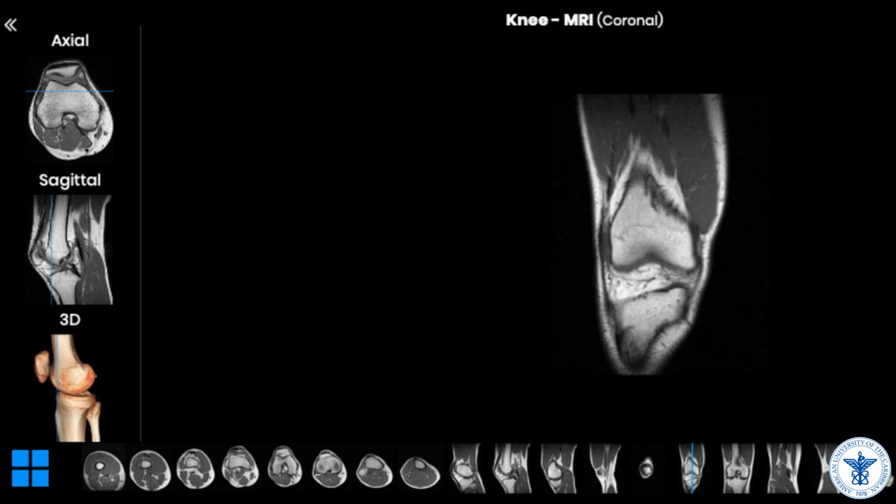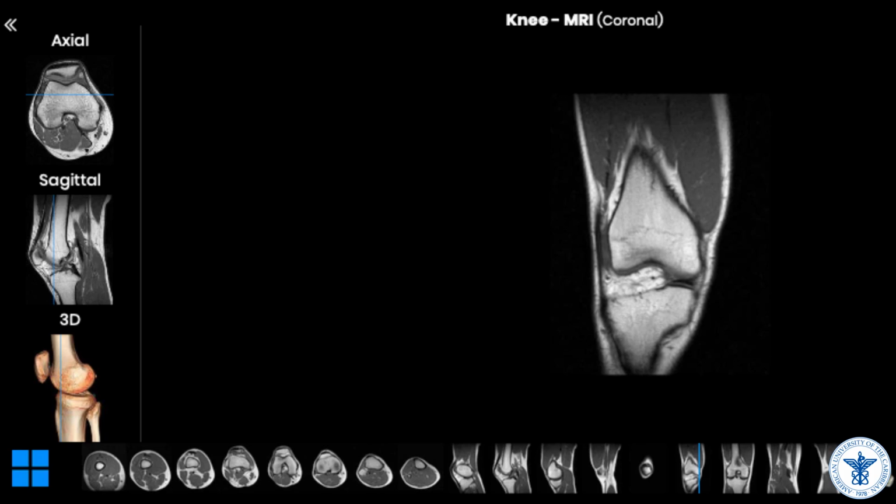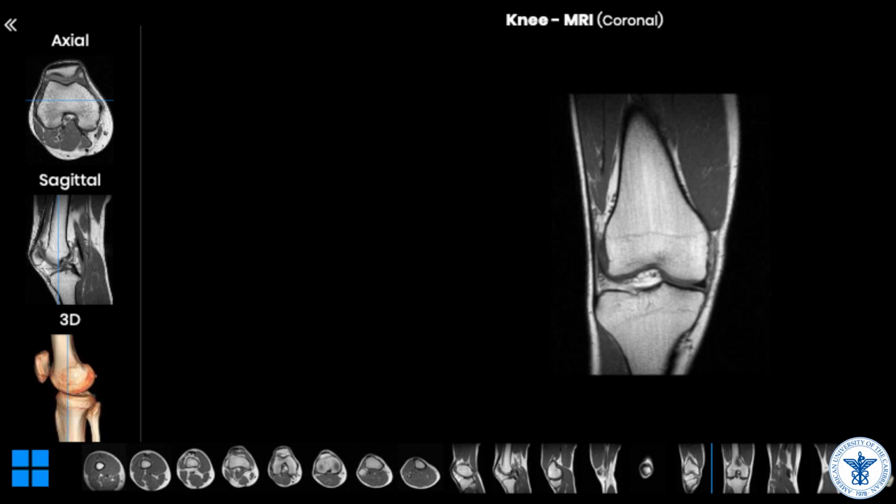And you see the other components of the knee joint, the distal end of the femur with two condyles appearing above, and the upper articular surface of the tibia appearing just below. Here they are. As they approach each other, you can see the other structures around.